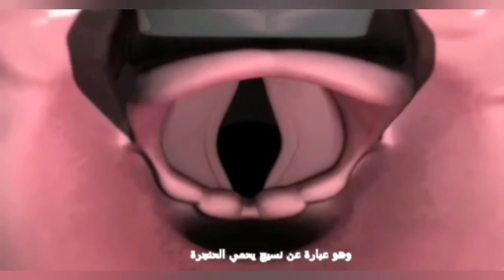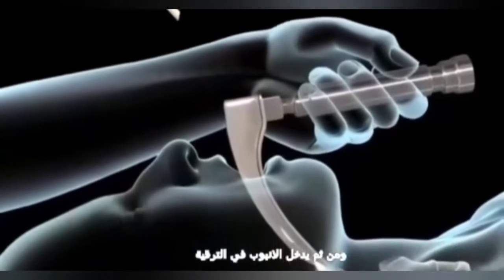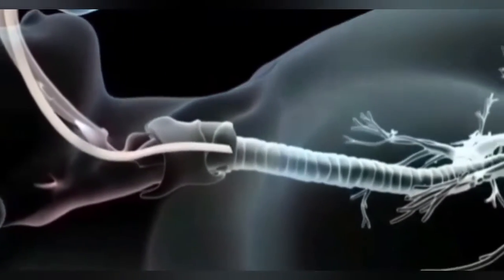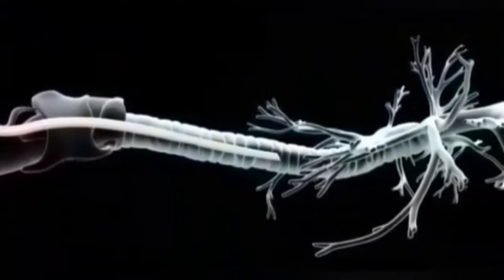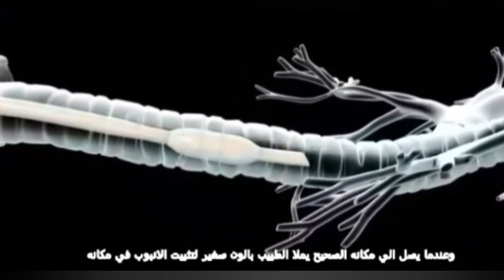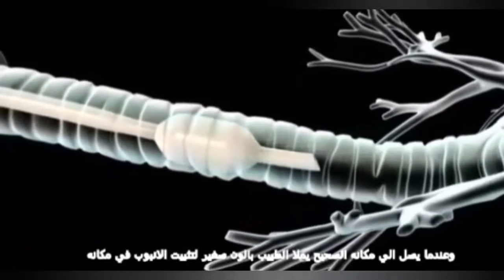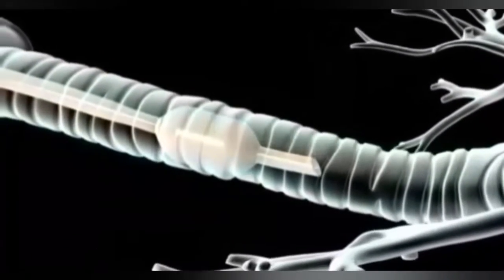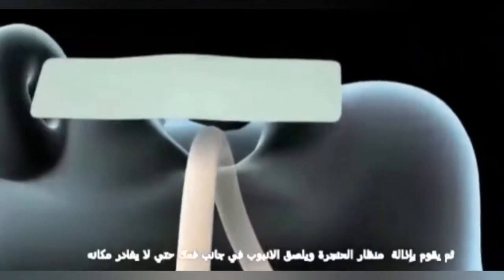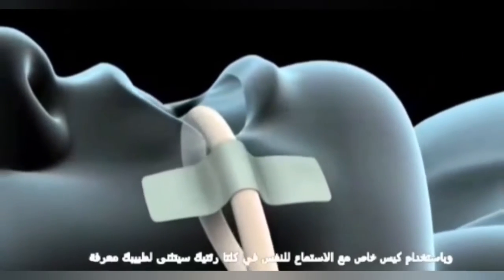Your doctor will gently raise the epiglottis, which is a flap of tissue protecting your larynx, as they advance the tip of the endotracheal tube into the trachea. Once the tube is in place, your doctor will inflate a small balloon surrounding the tube to make sure it remains snugly in place. They will then remove the laryngoscope and tape the tube to the corner of your mouth to prevent it from being jostled out of position.